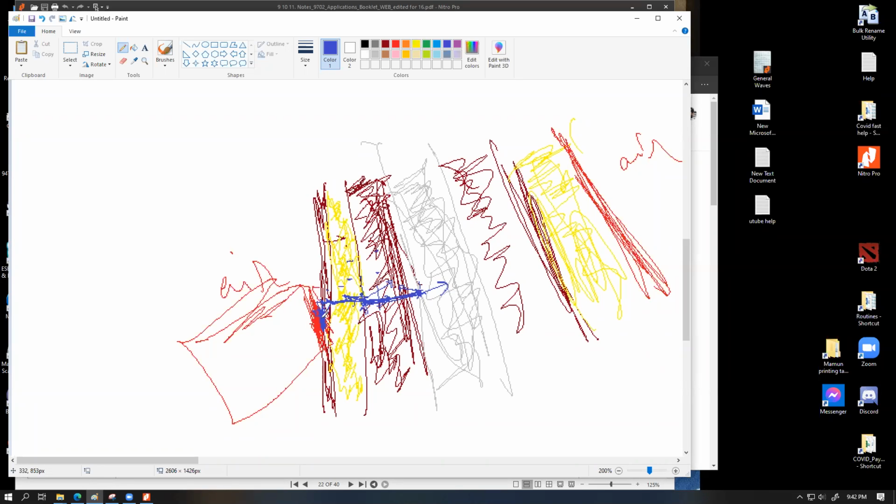Depending on this time variation and on the intensity, we can decide exactly what the construction of the body tissues is along that line of the sound traveling.